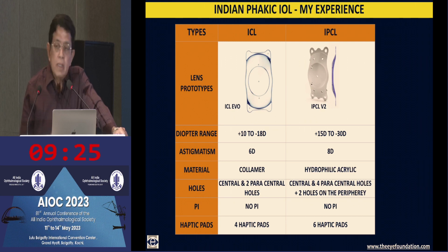The approach for us as far as these phakic intraocular lenses are concerned is very much like what we do with Indian and imported intraocular lenses. We do tell them that ICL is the first one off the block. It has certain considerations, and there's a lot more experience with it. But if cost is a consideration, which is very often the case, because most patients require a bilateral toric implantation, and with a toric ICL, it becomes too expensive. So we do not want to deny this technology to our patients. Whenever it's necessary, we counsel them and use both these lenses.